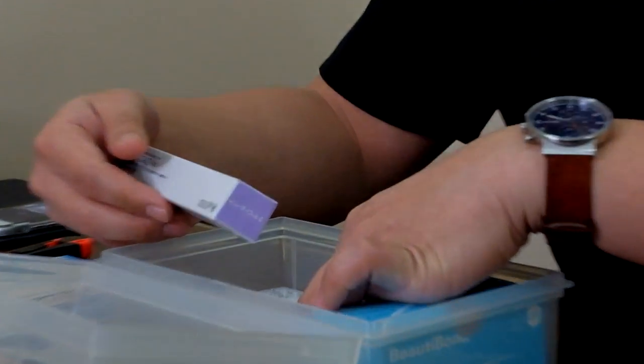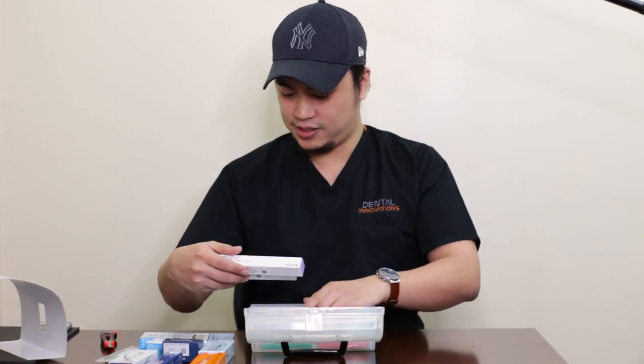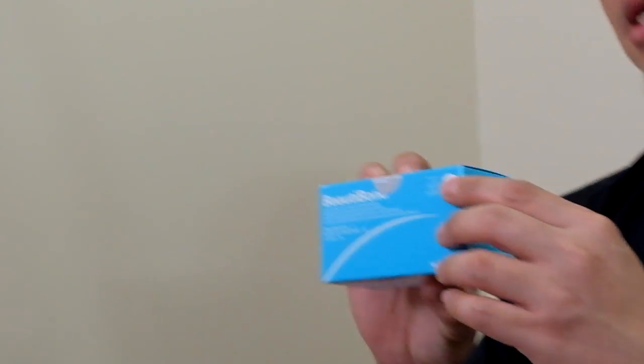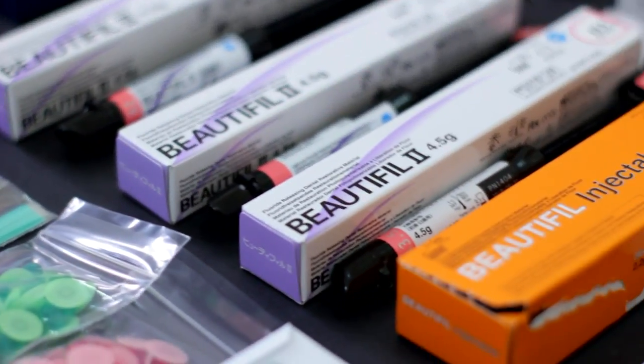We have Beauty Fill 2 — three shades here with us. The Self Etching Beautiful Bond right here. And the Interproximal Polishing Strips. Guys, look at this — look at how many boxes are within the box.